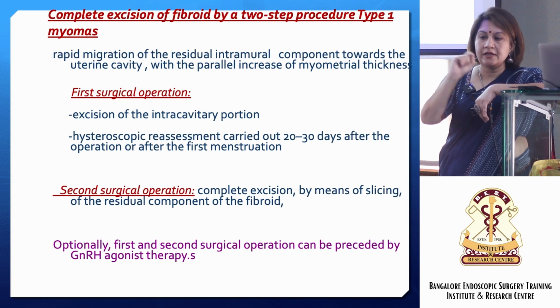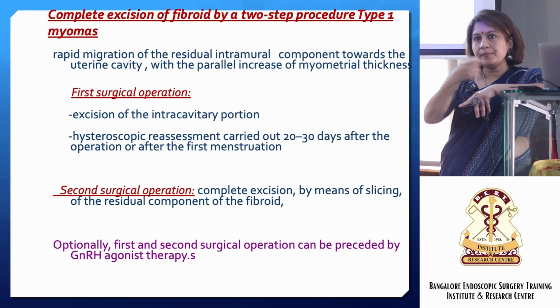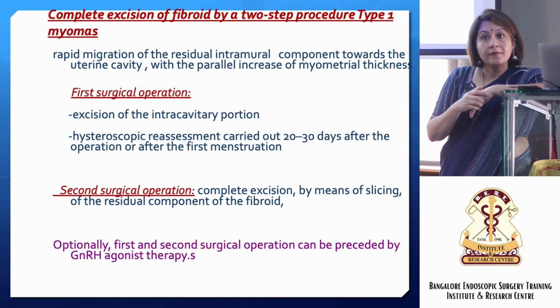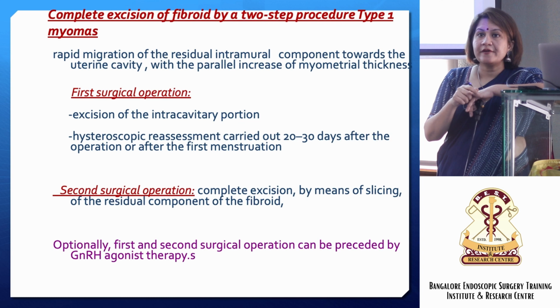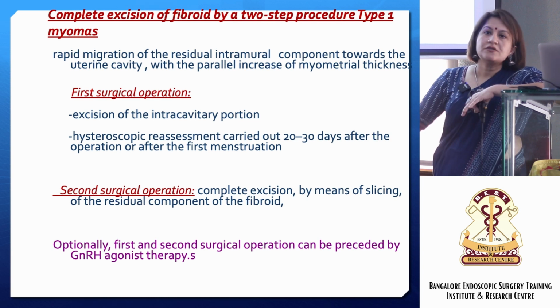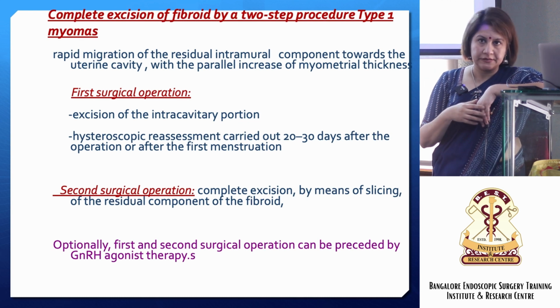It's a rotatory system over there. It keeps chopping like a chopper, and as it chops, it sucks the tissue, very tiny tissues, but over a period of time it eats up the whole fibroid. That will take time for a large fibroid, but for a small fibroid, for a polyp, for everything, it's very useful because it's mechanical. But the costing is so much more, so either they'll bring the costing down, or we'll have to wait and see.